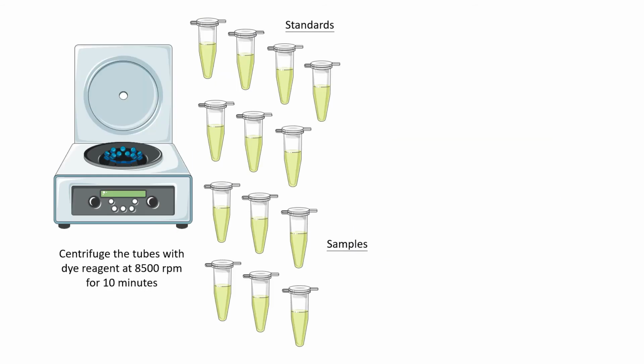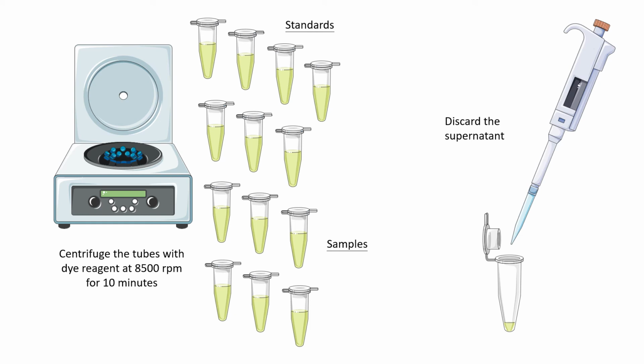We're going to do a centrifuge step again. Similar to what we did before, we're going to centrifuge our tubes at 8,500 RPM for 10 minutes. And once again, the supernatant will be carefully discarded without now disturbing that pellet at the bottom, which this time will be our soluble collagen pellet, okay, or a pellet that contains soluble collagen that was essentially secreted by our mesenchymal stem cells while they were residing in our agarose gels in culture.